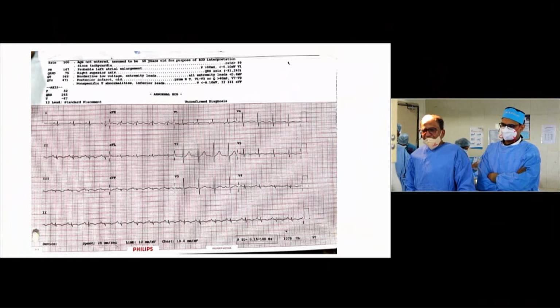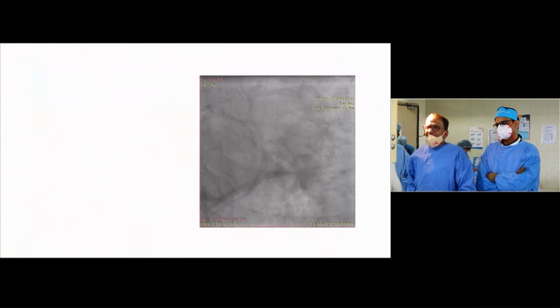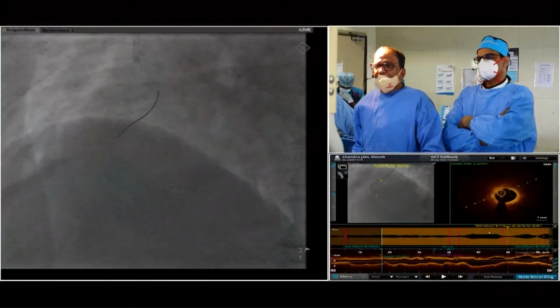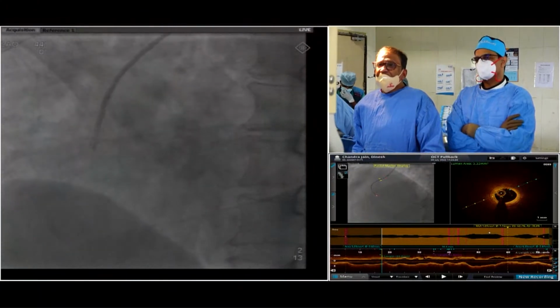Next. Can you go back to what we have done? Can you focus on the monitor here? Show us the screen now. Okay. Can you show from the first?